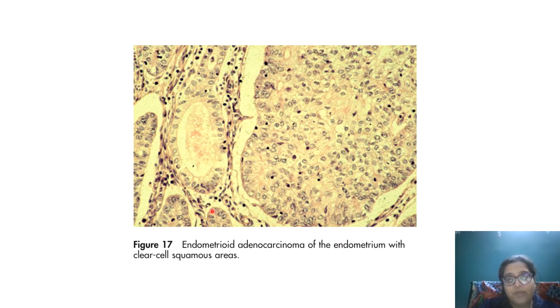So this is an endometrioid carcinoma. Serous you can differentiate by a more well-formed gland. This looks like a solid area or a squamoid area, if I might say so. That is why I said if you get a squamous morule, go for deeper sections, look for radiology, and then rule out malignancy in a biopsy.